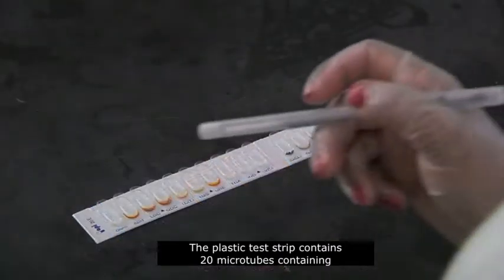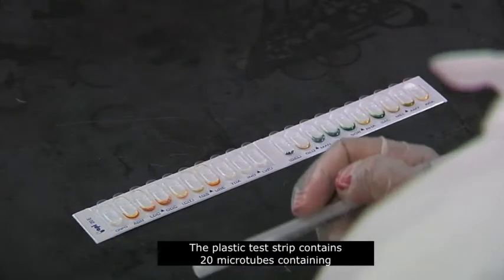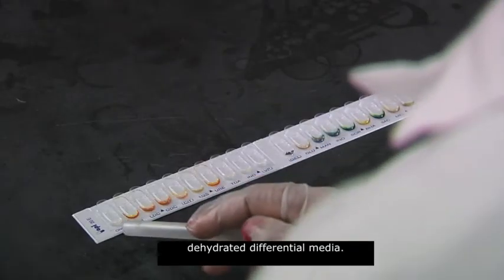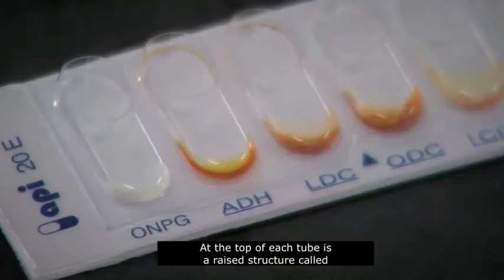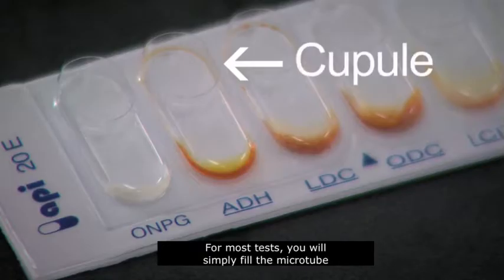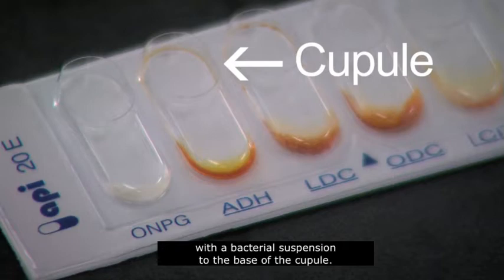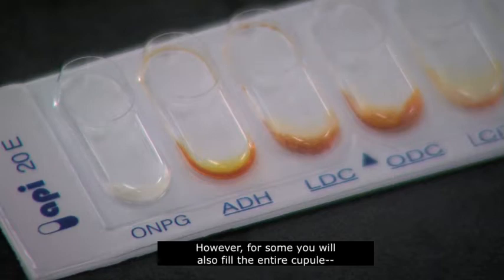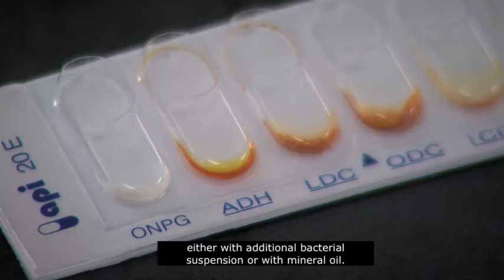The plastic test strip contains 20 microtubes containing dehydrated differential media. At the top of each tube is a raised structure called a cupule. For most tests, you will simply fill the microtube with a bacterial suspension to the base of the cupule. However, for some, you will also fill the entire cupule, either with additional bacterial suspension or with mineral oil.